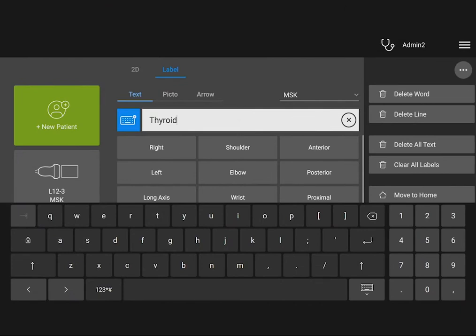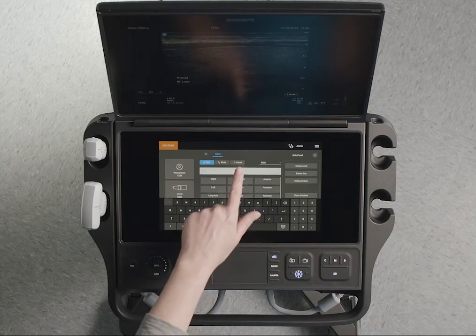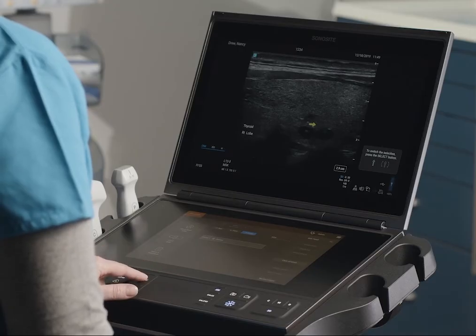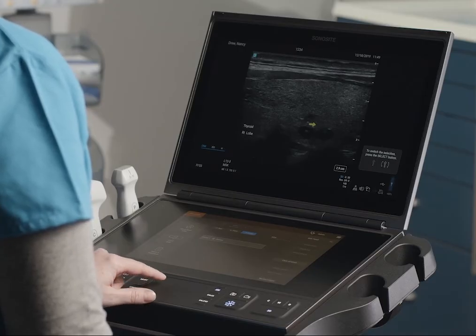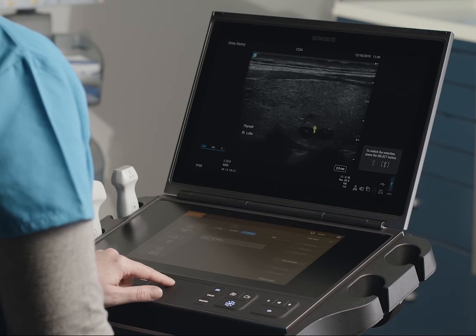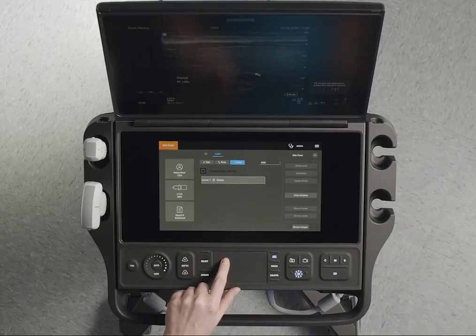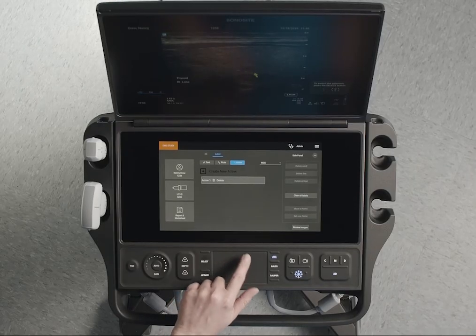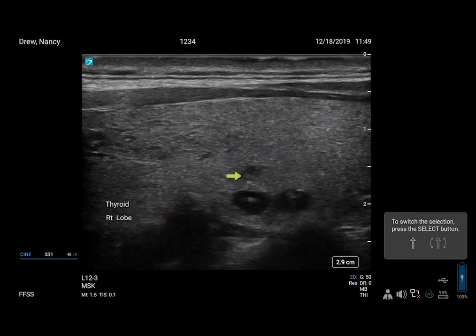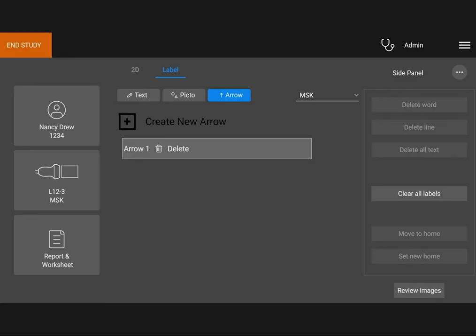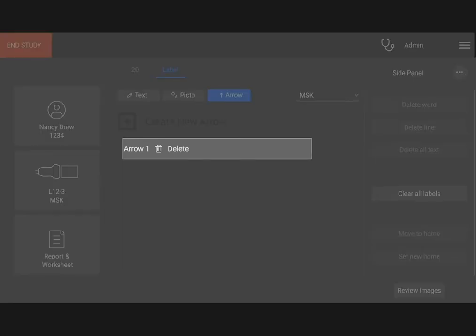Or you can delete it. Now, let's add an arrow. If you want, rotate the arrow by pressing the Select button and dragging your finger on the touchpad. Rotate it by drawing a circle around it with your finger. Press Select again if you want to move the arrow. To delete the arrow, simply tap Delete on the touch panel.